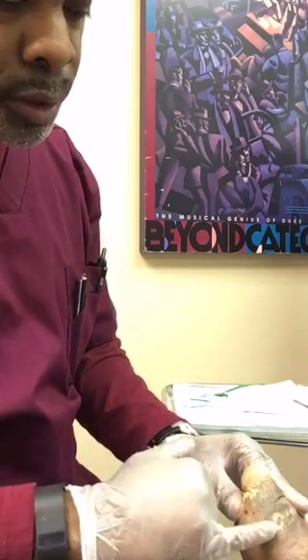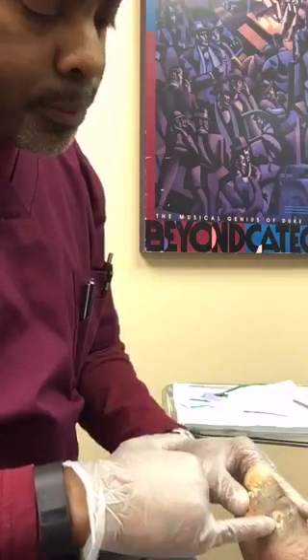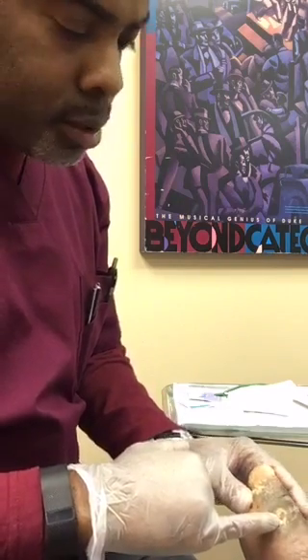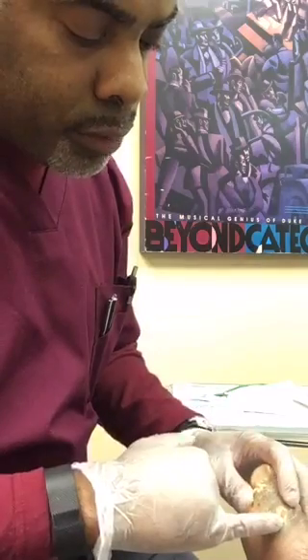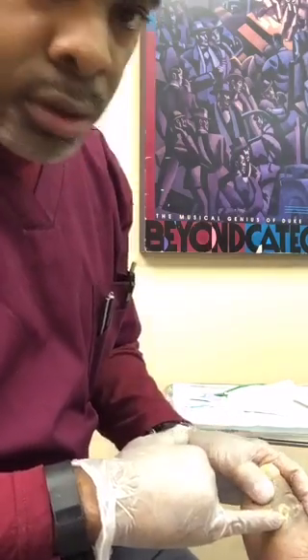I'm now on a graft application for a diabetic foot wound on the medial side. This wound has been present for about three or four weeks. It started as a big abscess that we had to drain. Now that the infection and everything's under control, we're going to get this all cleaned up.